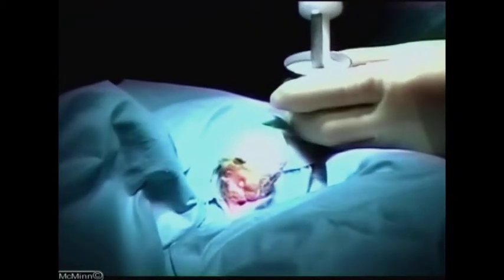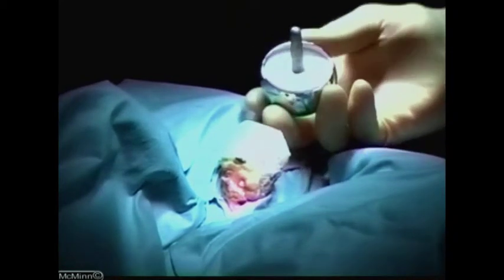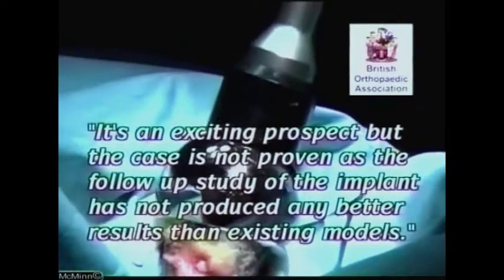Hip resurfacing removes very little bone, so if deterioration does occur later, a hip replacement can still be carried out, whereas resurfacing cannot be done if the hip has already been replaced. But the British Orthopaedic Association has reservations about the resurfacing procedure. It's an exciting prospect, but the case is not proven as the follow-up study of the implant has not produced any better results than existing models.